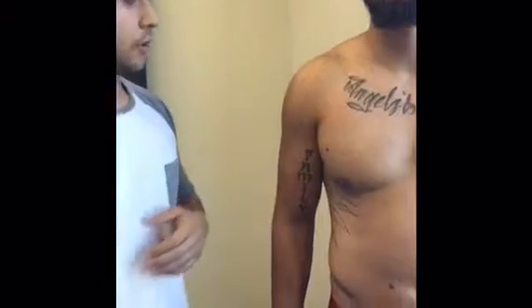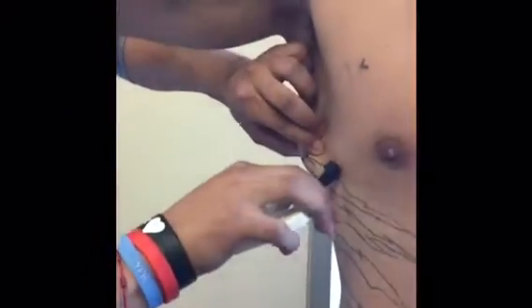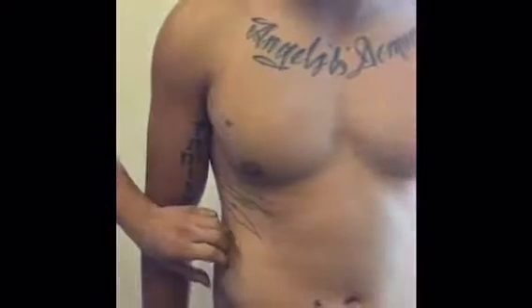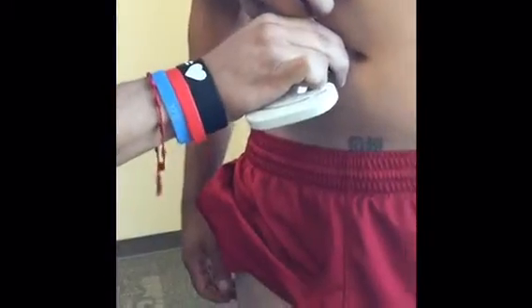Okay, so locating between the midway point of the axillary line and the nipple, diagonal fold, nice good pinch, and we got a reading of 12. Alright, so for the mid-axillary point, it's a vertical fold, getting the caliper right nice in there, and we got a reading of 9. Okay, so assessing the suprailiac, it's another diagonal fold, so we're going to go right above, superior to the iliac crest, get a good nice pinch, and we got a reading of 14. Okay, so locating the abdominal portion of the assessment right here, it's a vertical fold, nice good pinch, and we got a reading of 9.